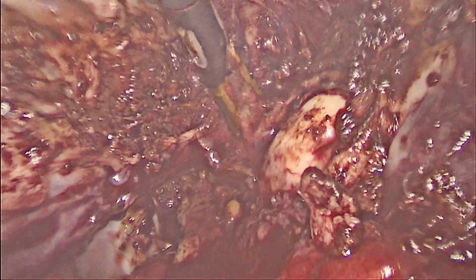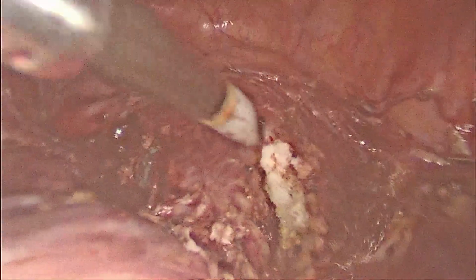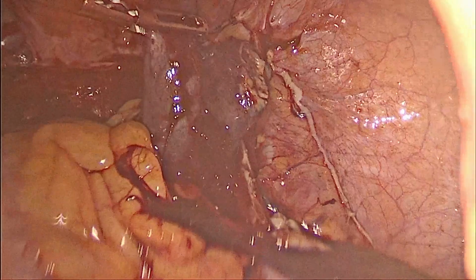We can see the right side adnexa is still stuck to the sigmoid colon due to its adhesions. We are trying to divide the uterine vessels now on the right side. After the division of the uterine vessels, we go to the transcervical ligament on the right side, and then use unipolar to divide the vagina from the cervix on the right side. So this completes the hysterectomy part of it. Still we have to tackle the adnexa of the right side.